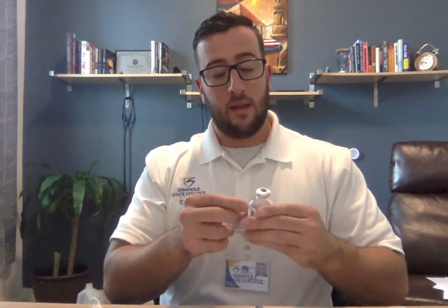Once I do that, then I want to go ahead and I'm going to grab my vial. It's a multi-purpose vial, so for this case, it's going to be my first time using it. So I want to go ahead and label it. So I got a basic piece of tape here. So I'm going to go ahead and write my initials, BA, then 5/11/2020, and then 1458 is my time. Go ahead and label here.